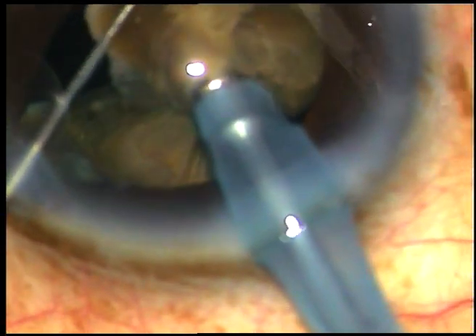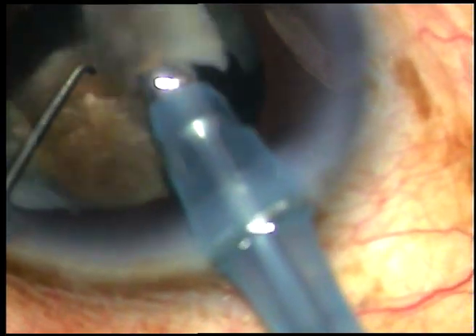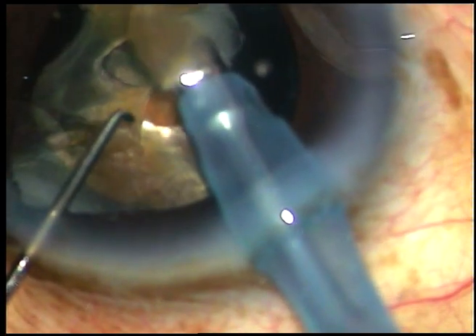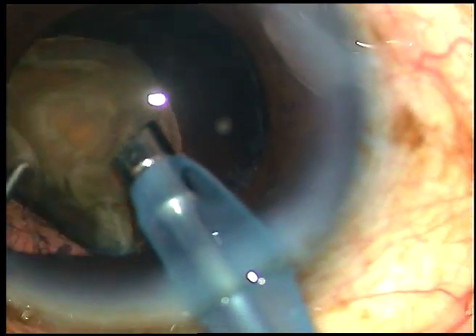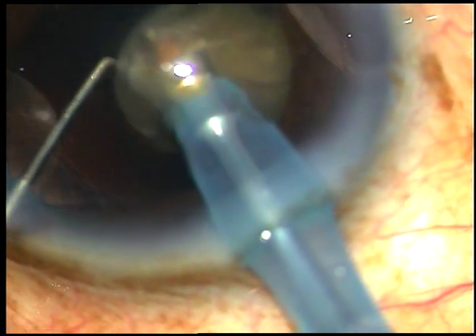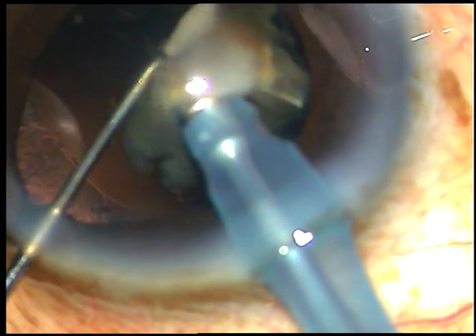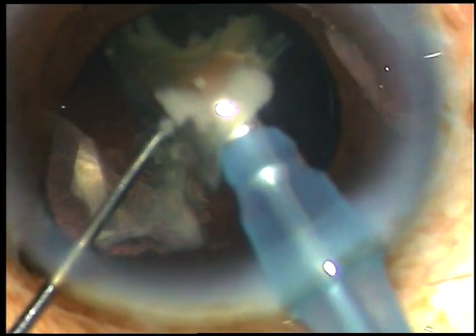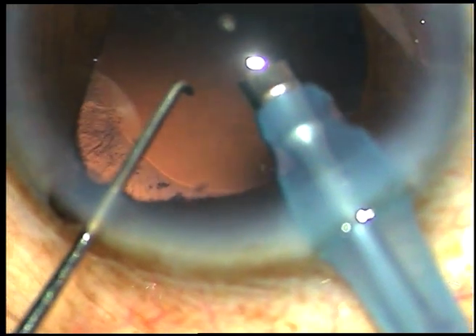These are the last two fragments. I am emulsifying the fragments and removing them. This is the last small fragment. I am keeping an eye on the posterior capsule — it is far behind. I am at the anterior capsular plane, and here is the last bit of nucleus being emulsified.